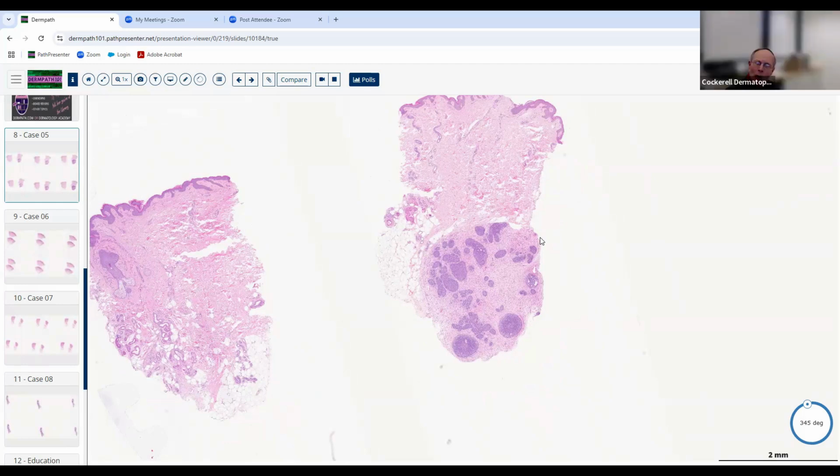When we look at this at low power, though, we had the angiomyolipoma a minute ago. What's the predominating component, or at least 50% of the volume of the lesion in this case? Predominantly, it was more of a basaloid appearance to me. We've got two things, right? We've got this, and then we've got this. So that's, I think, more of a fibrous stroma surrounding those basaloid cells.